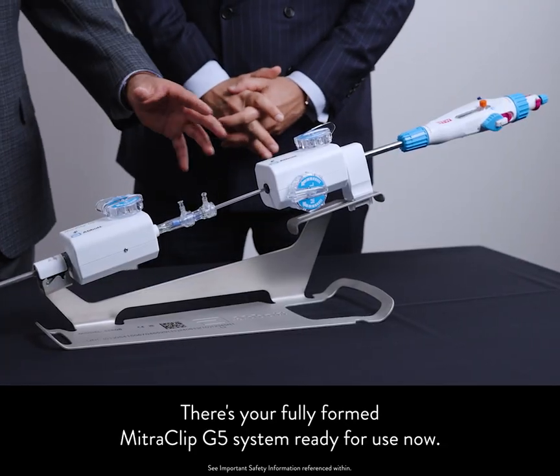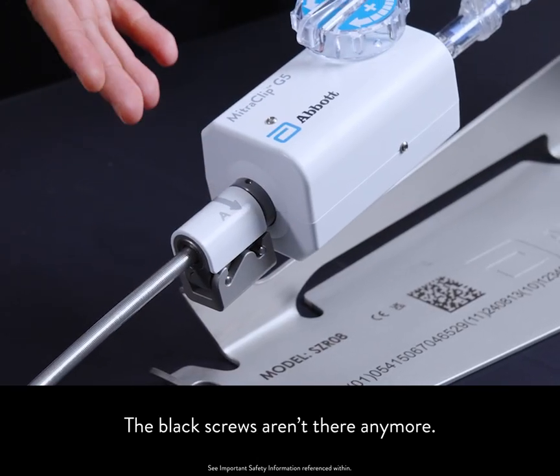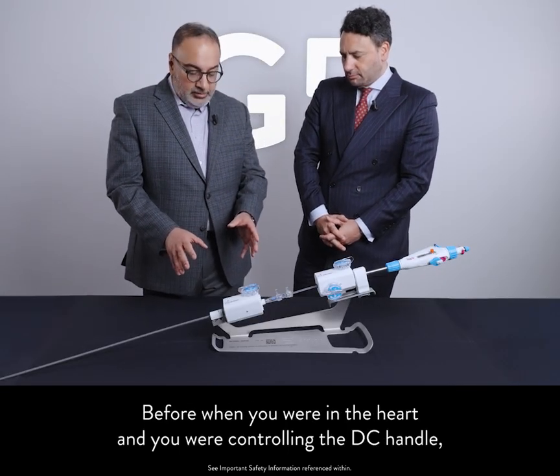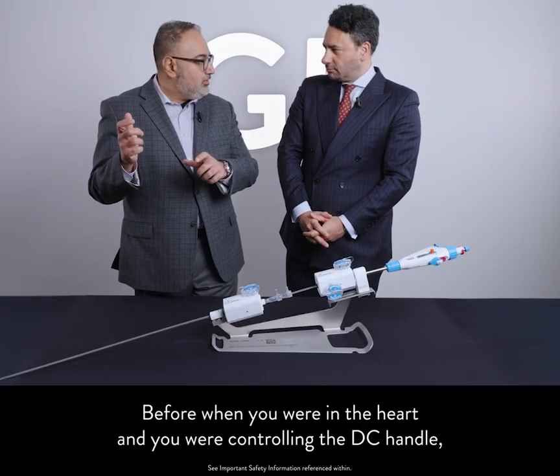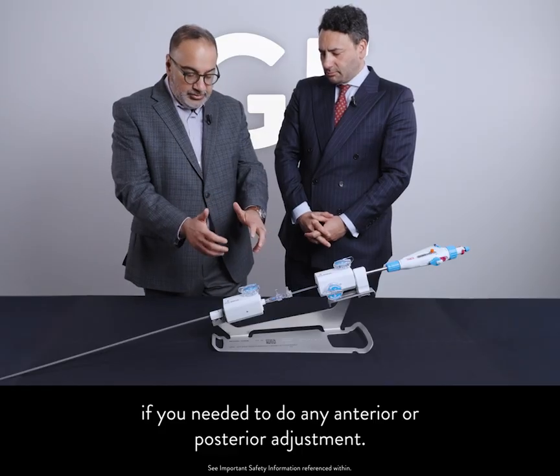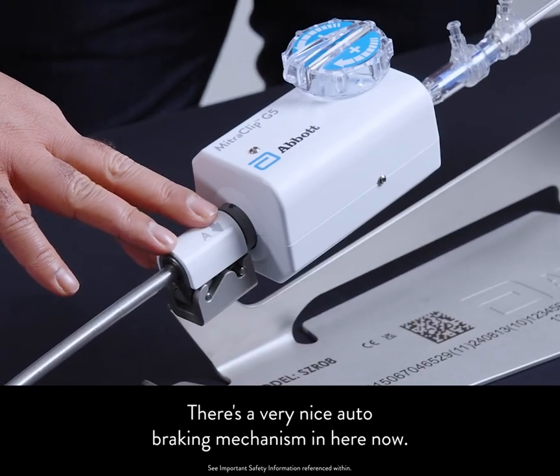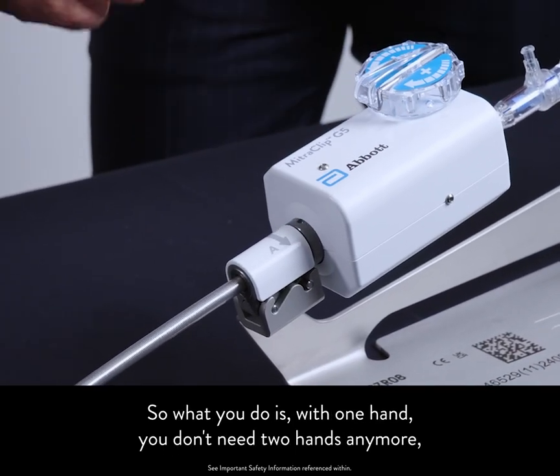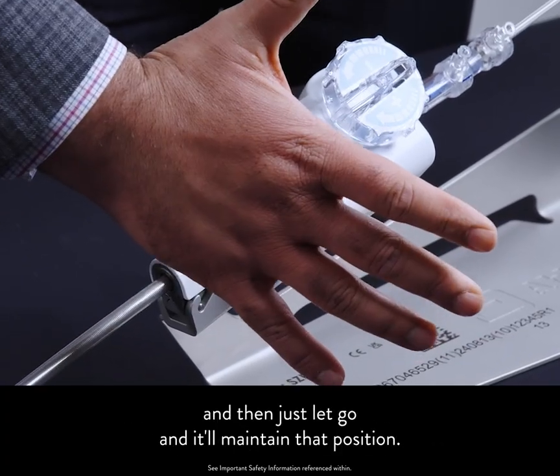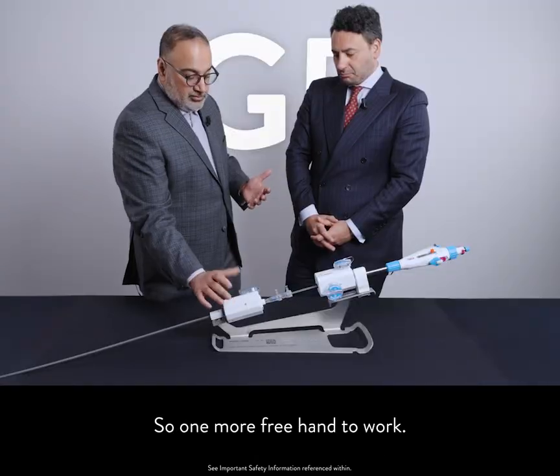There's your fully formed MitraClip G5 system ready for use. I see it's a major change — completely different, the black screws aren't there anymore. From an efficiency standpoint, this is a fantastic improvement. Before, when you were in the heart controlling the DC handle, you had to fasten the DC handle, move both hands to the guide. If you needed to do any anterior or posterior adjustment, you had to unfasten, rotate, refasten. That's all gone. There's a very nice auto-braking mechanism now. With one hand, you simply rotate one way and let go, and it'll maintain that position. If you don't like it, rotate the other way and it'll maintain that position — so one more free hand to work.